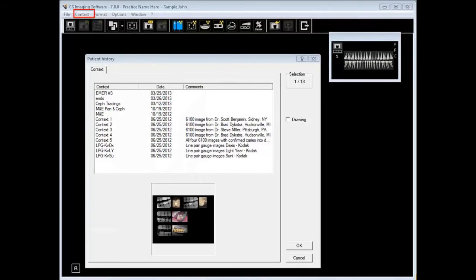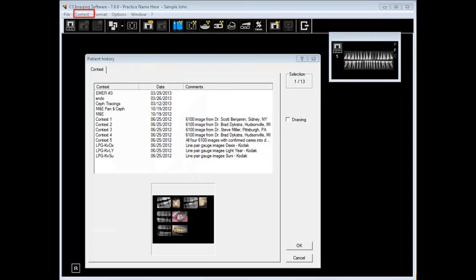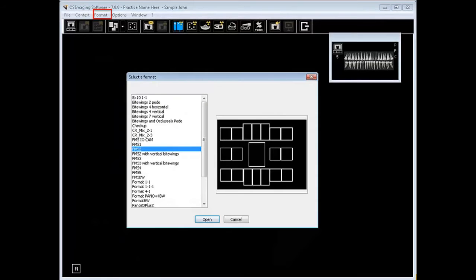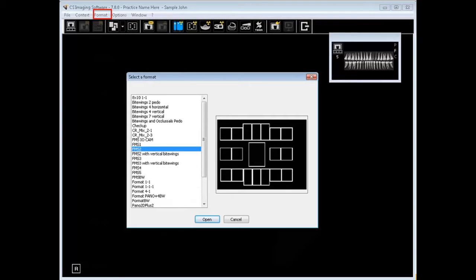Context is the next menu item. You use a context to save and retrieve a current display of images. Images, regardless of their format type, such as intraoral photos and radiographic images, can be saved in the same context. This makes it easy for retrieving. Select a required format from the drop-down. Format allows capturing a series of images.